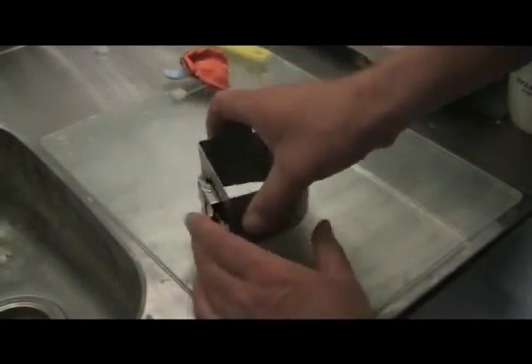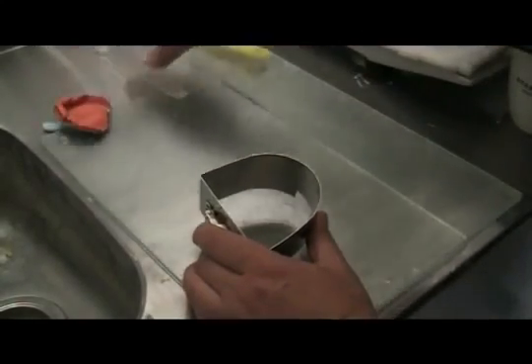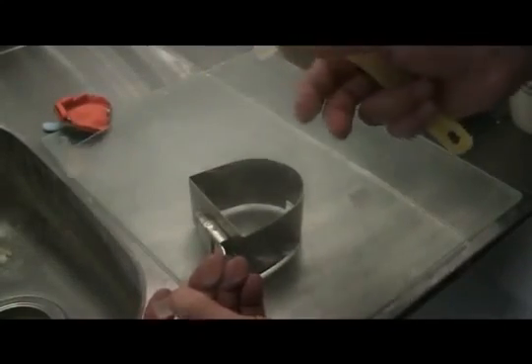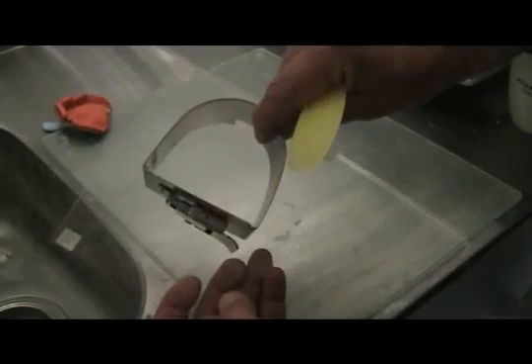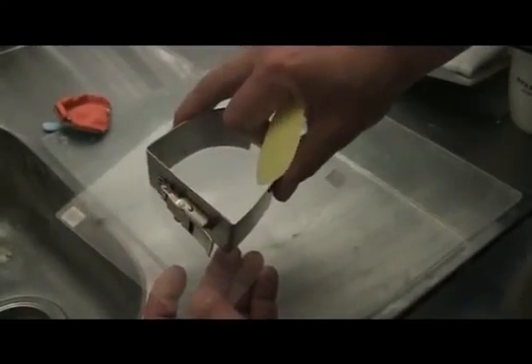A couple of little things that I couple along with the former to make it a much easier system to use are a piece of plexiglass and a handle with a flat end. The plexiglass is about 5 inches by 5 inches, and it accommodates the patty that you'll be creating with the Wonderfill in order to use the Wonderformer to cut a cookie cutter type form around the patty.